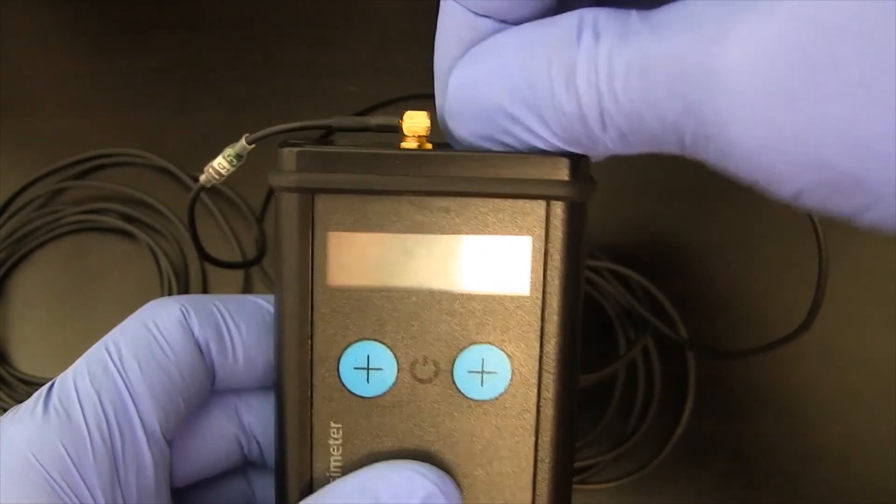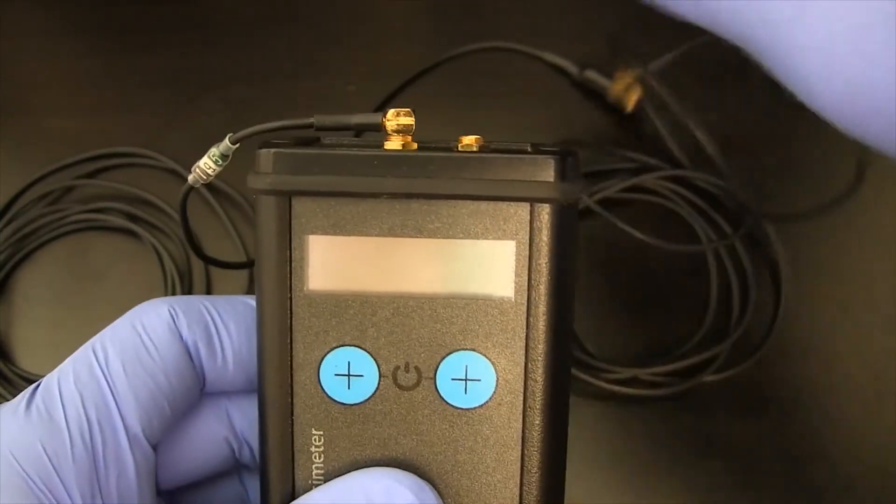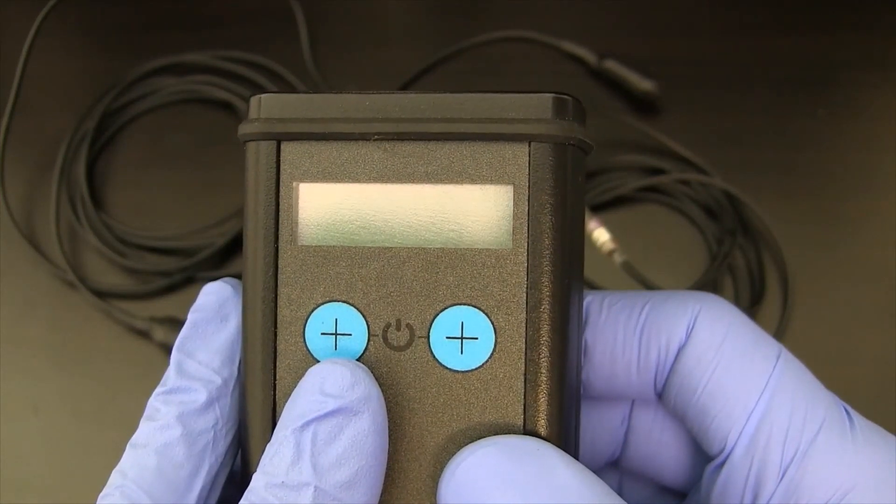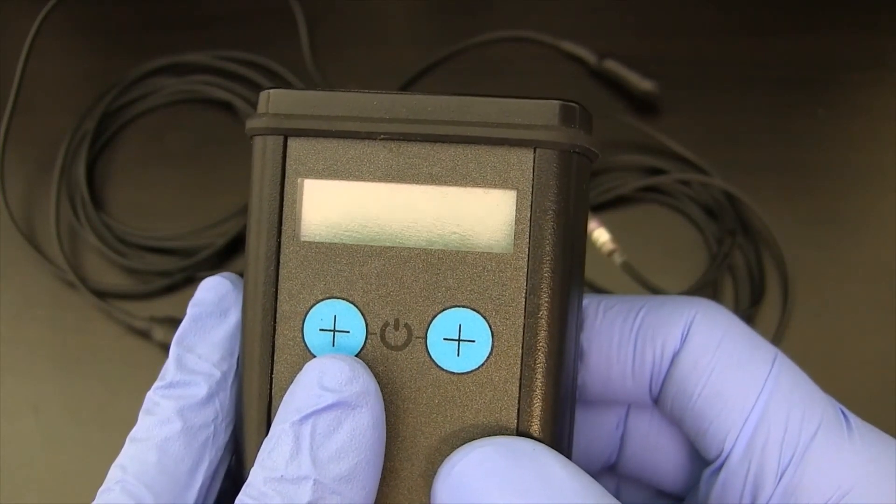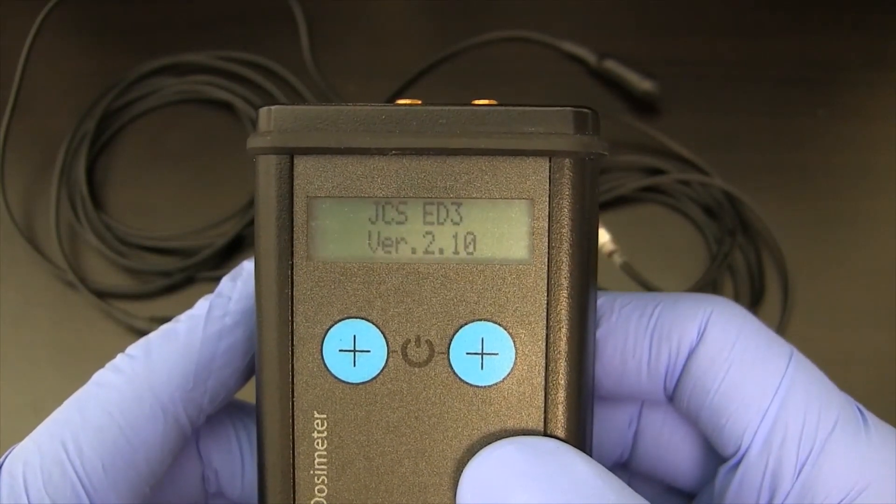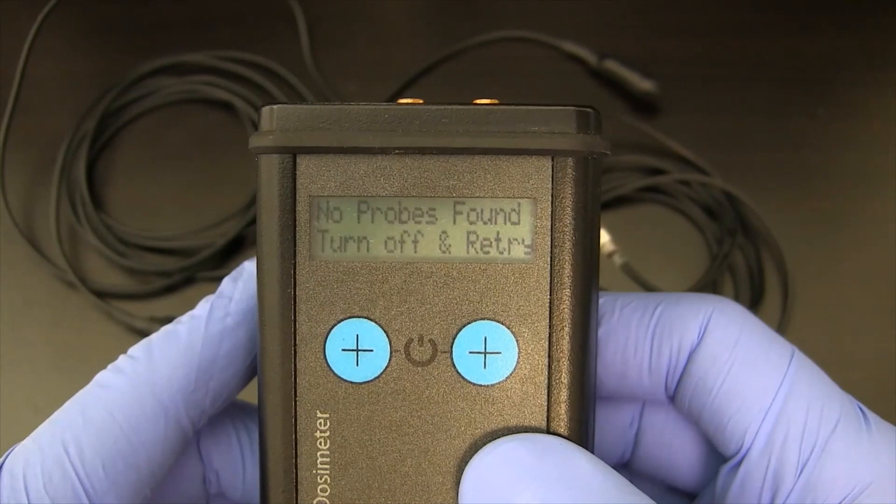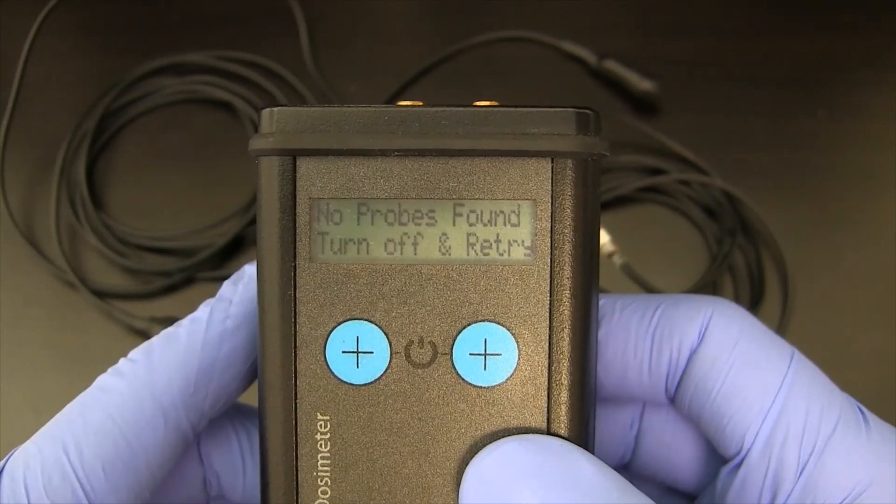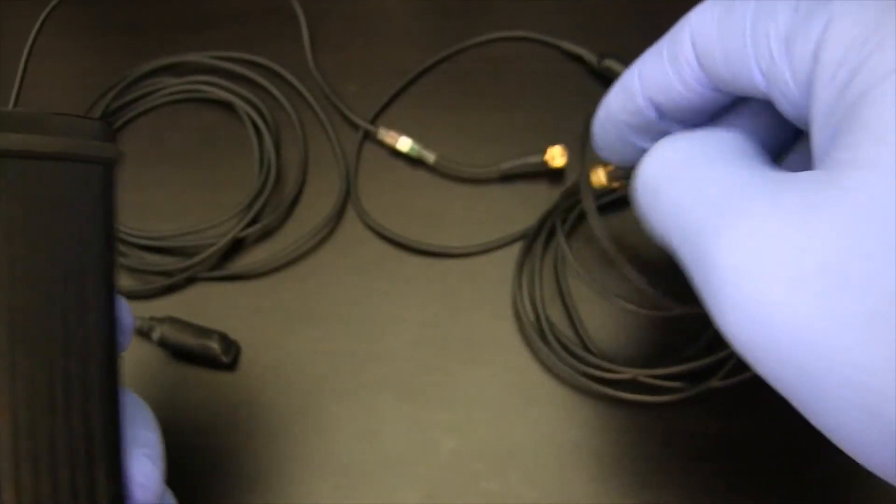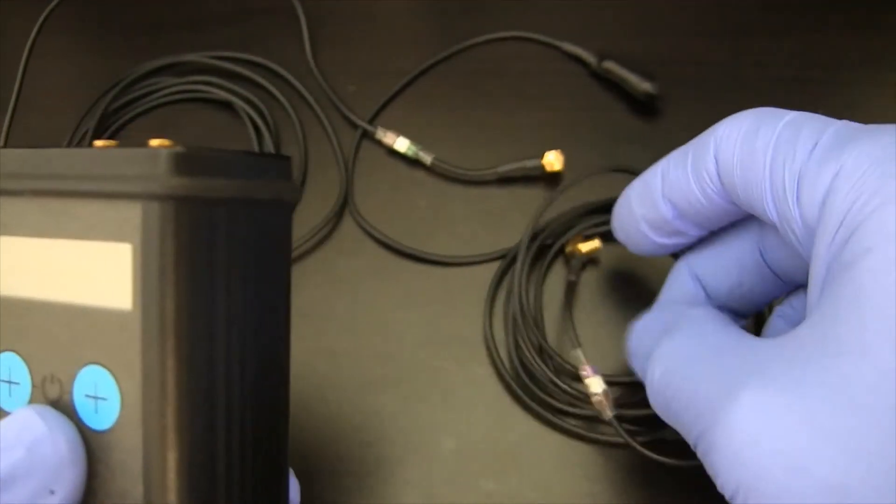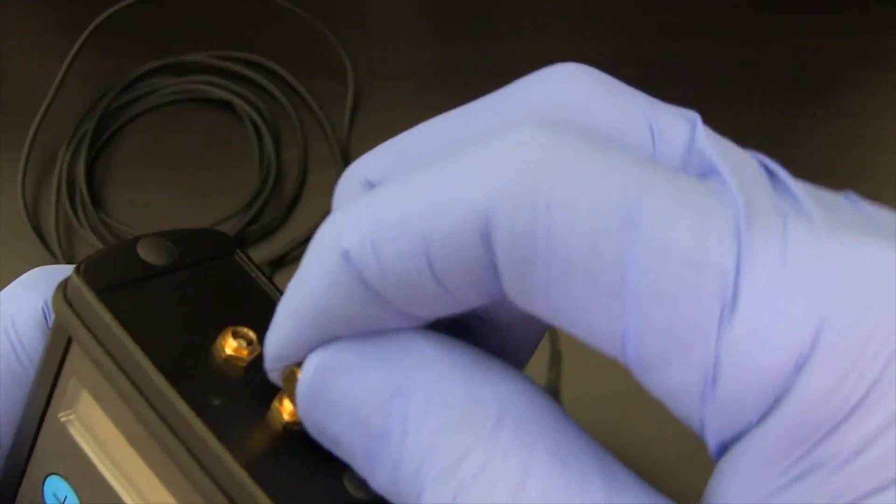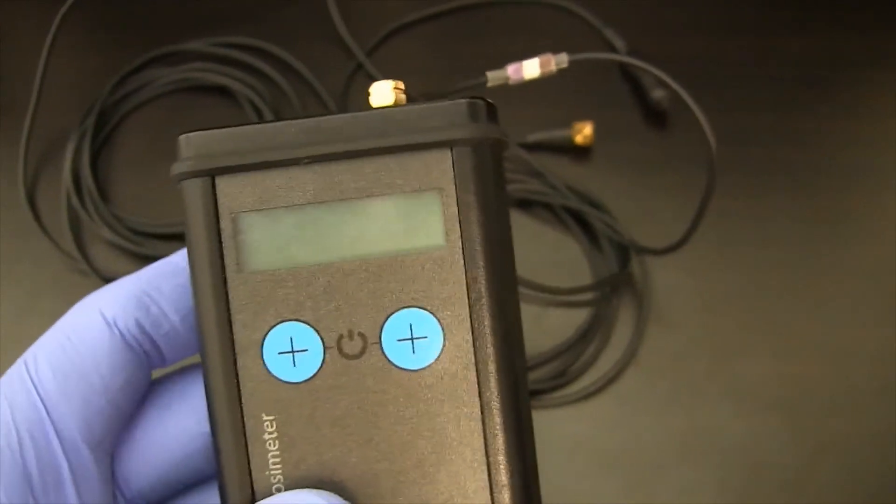But let's do something else. What we're going to do is disconnect both of the detectors and turn the unit on. The unit is smart enough to know if a detector is not connected. And it's telling us no probes are found. Turn it off and retry.